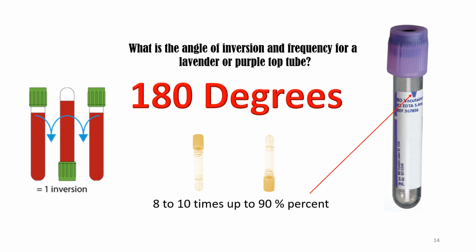Therefore, if the person that is taking the blood test does not invert in the proper angle, does not fill the tube at the proper level, then what's going to happen? That already is coming with errors. And when that reaches the lab itself and they analyze the blood specimen, it will come with an error that you cannot really fix because it's already done.